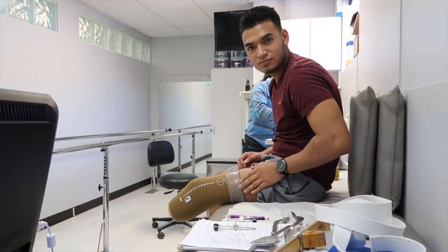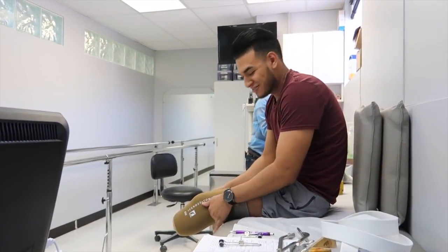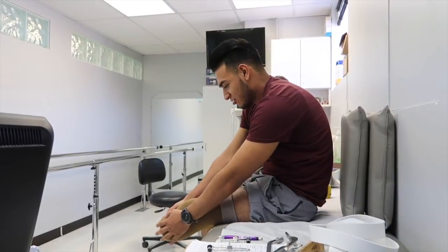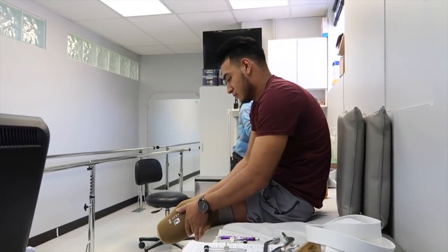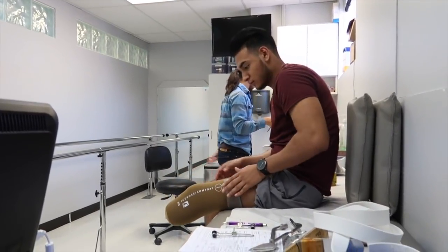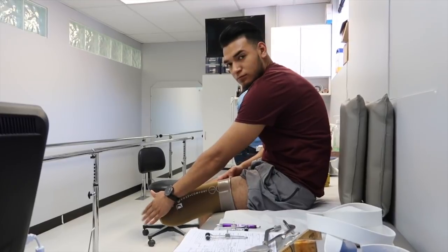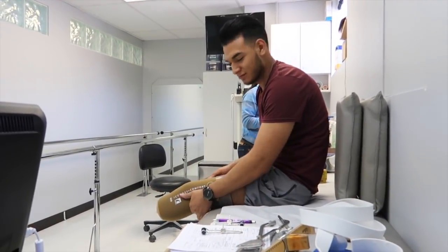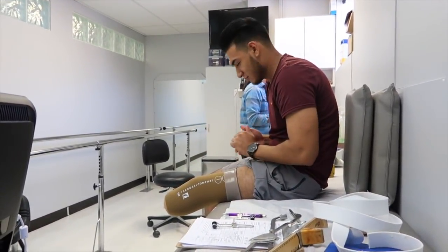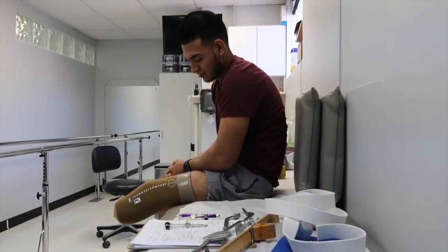How does that feel? It's a lot of compression — it feels good. You're still scared of the pen? You'll be fine. What do you think? That's the beginning. Yeah, and we'll trim that like you said.